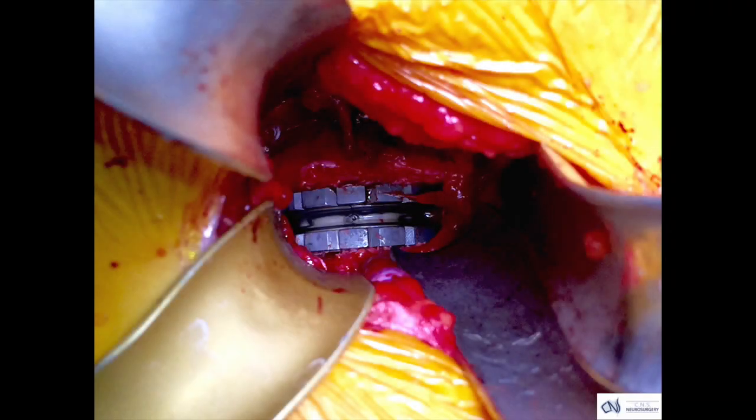This intraoperative photograph shows the device in place. You can see the titanium metal coloured plates above and below. They surround the flexible polyurethane core of this artificial disc.